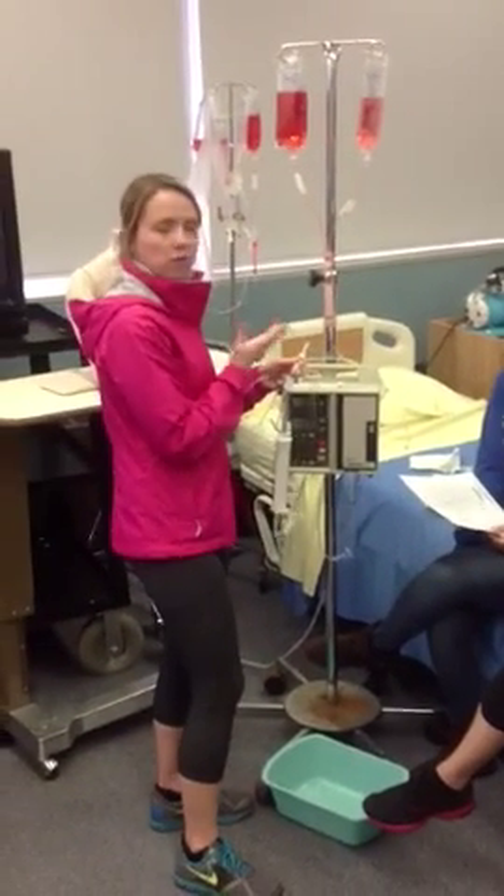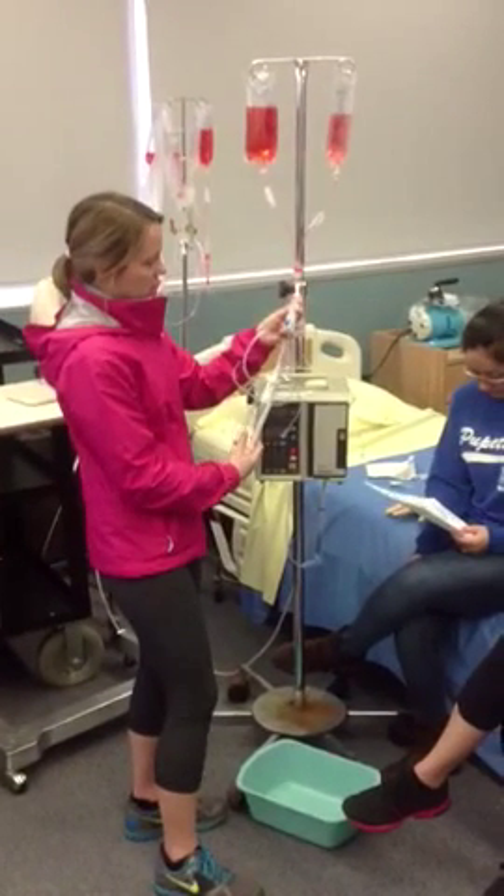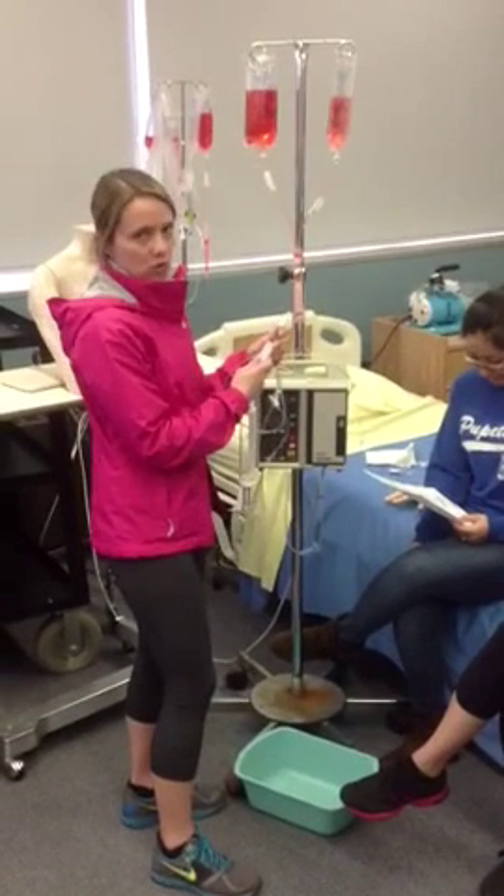We're setting up a pediatric patient who is getting fluids. We're going to use a Buretrol to reduce the chances of fluid overload.